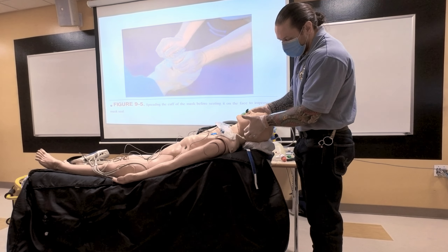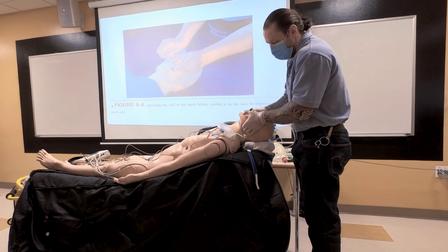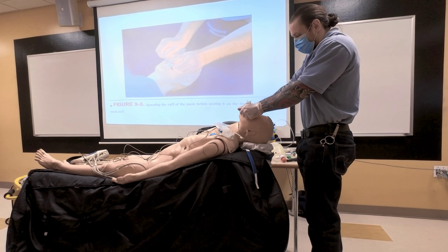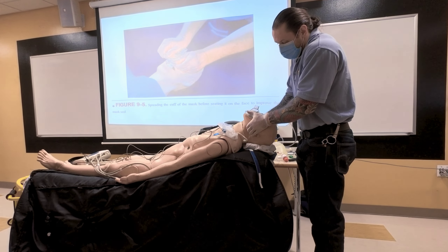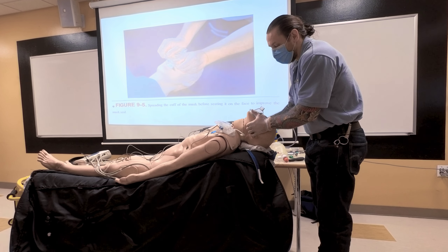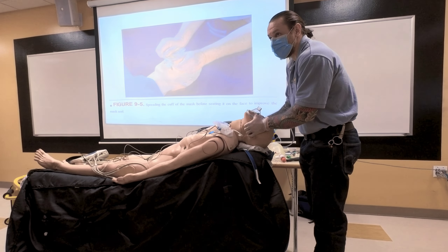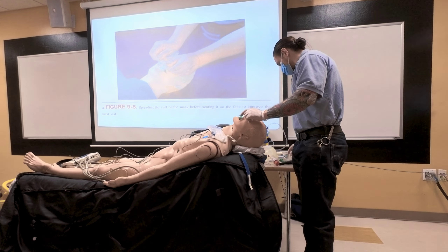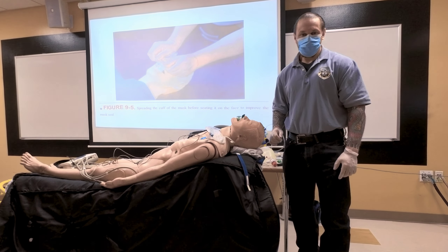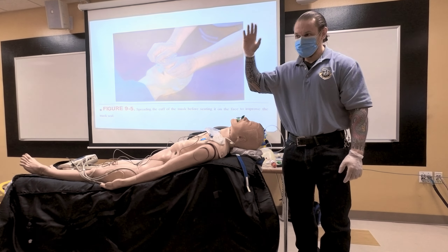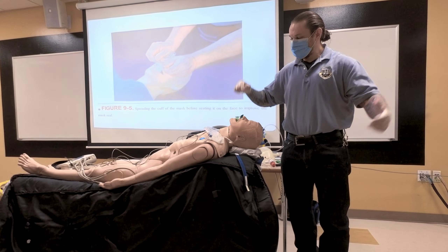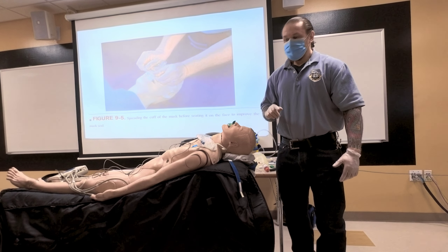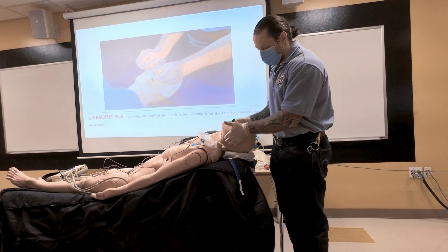Then take your BVM and disconnect the mask. Spread the cuffs and put it on the bridge over the nose. Why spread the cuffs? You get a better feel — soft tissues are going to grip. Next we're going to do a two-handed triple airway maneuver. Take the index finger under the mandible, lift the jaw to the ceiling, thumbs open the mouth, lift the head back. With the mask on: spread the cuffs, seal, and lift. This will give you the best possible air entry and ventilation.